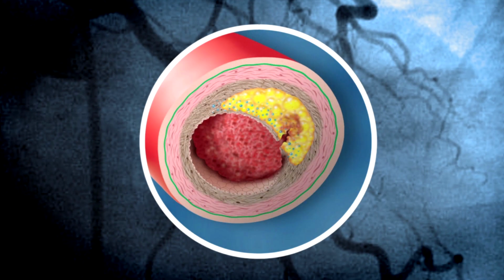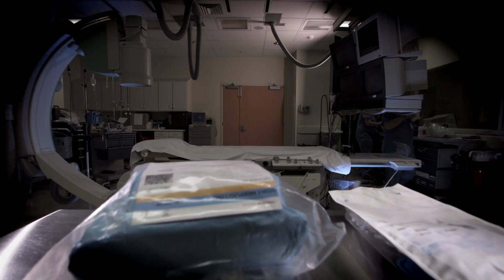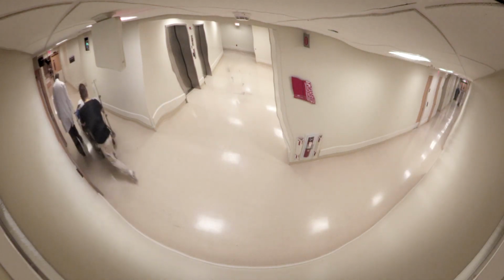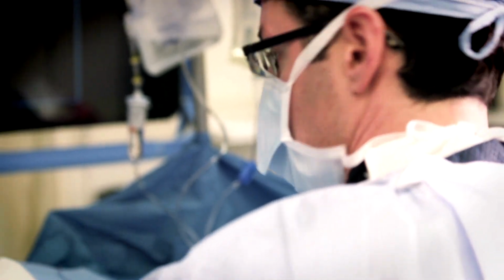When a patient presents with blocked arteries, stenting may be sufficient to keep blood flowing. The procedure takes place in the cath lab. The patient is awake and alert. A local anesthetic is applied to numb the catheter insertion area. Then the narrow areas of the arteries are located by injecting dye and reviewing live X-rays called fluoroscopy.